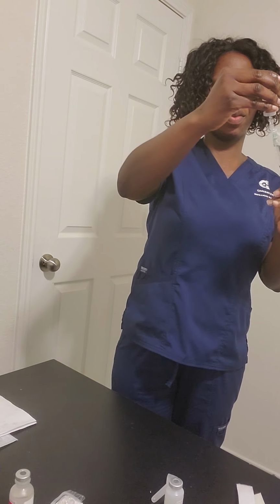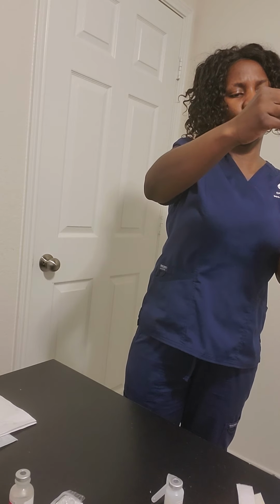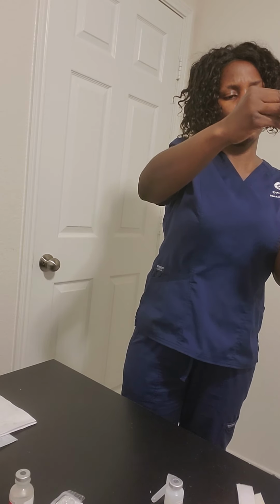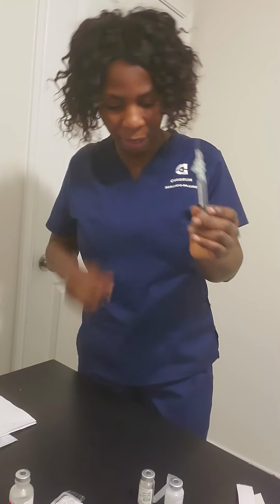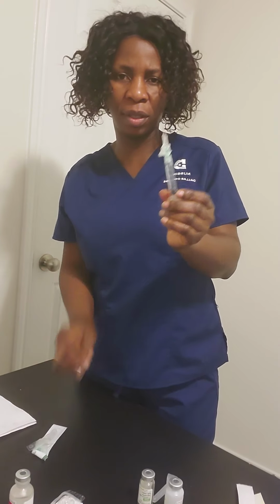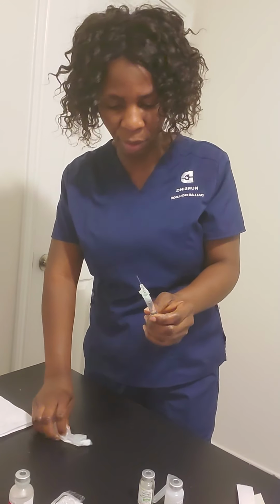Good. I was trying to make sure I withdraw completely the total 1 gram. I have been able to withdraw the total 1 gram, and there's nothing left in the bottle. So I'm going to put it down, and the next thing is I'm going to change the needle because I'm not going to use this to administer it.